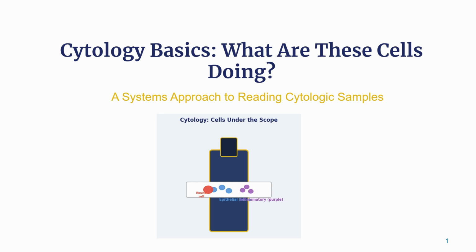Cytology is the art and science of looking at cells to understand what's happening in a tissue. It's one of the most valuable and most accessible diagnostic tools in practice. A fine needle aspirate, a smear, or an impression can give you an answer in minutes that might otherwise take days and a biopsy to discover.